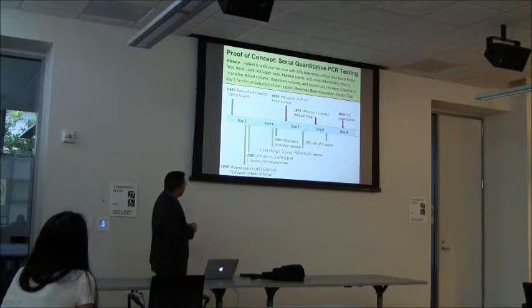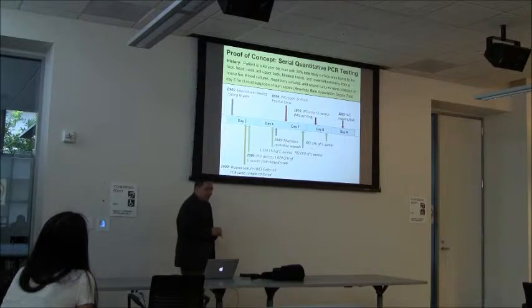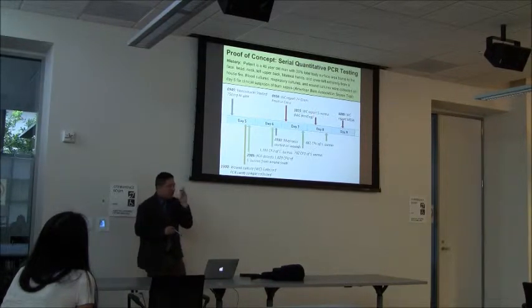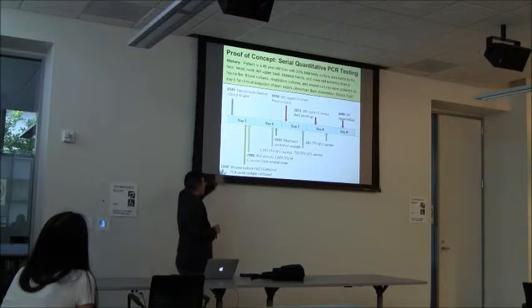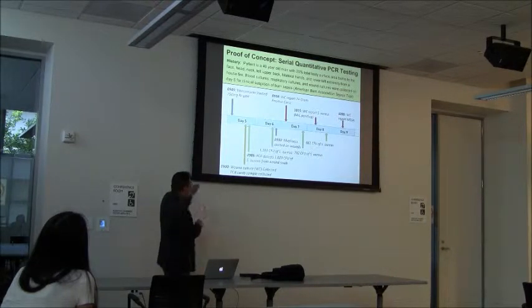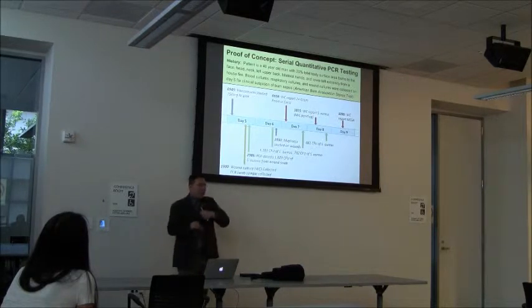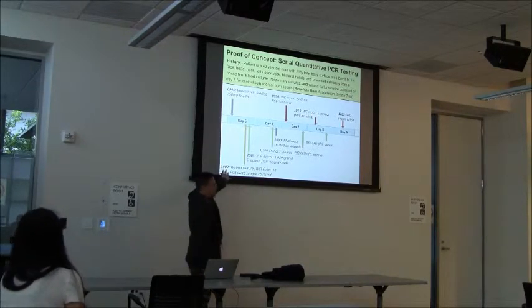On day 5, the nurse called me up and said this gentleman has what looks like a wound infection on his face. The wound doesn't look that great. So the resident physician ordered a swab. They collected one swab and sent it to the micro lab for culture. They gave me another swab, which I ran on the PCR. This was at 1900 hours.